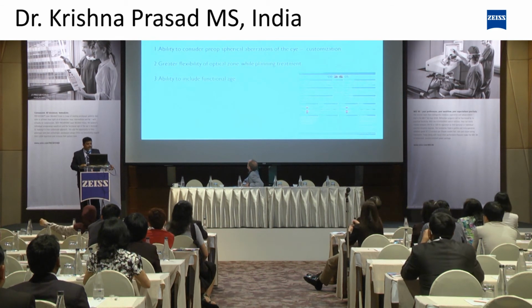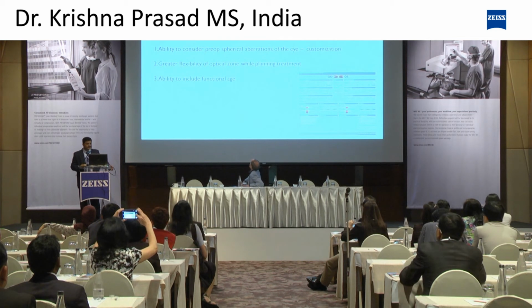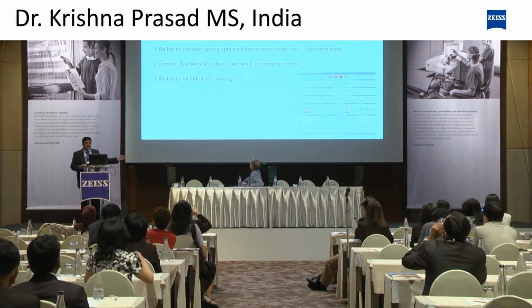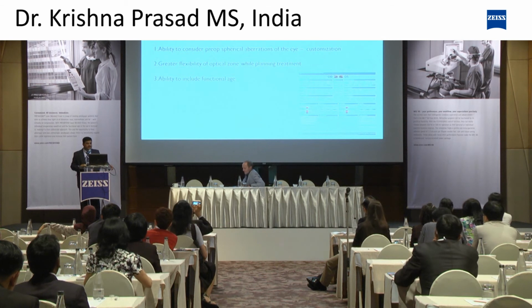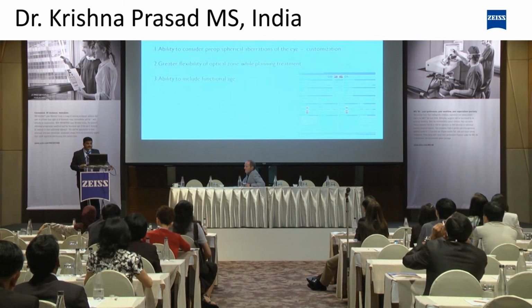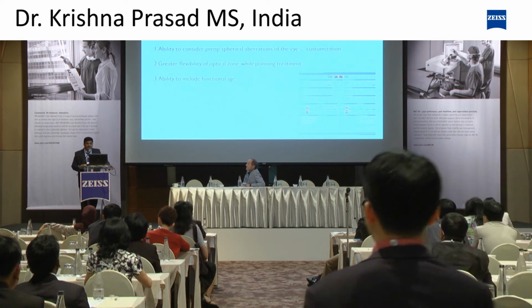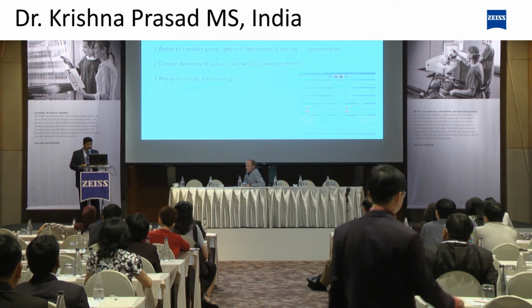Coming to the new software that is available nowadays, they are giving the laser blended vision software. Now they are coming with the newer Presbyond software. The advantage is that it has the ability to consider the preoperative spherical aberration of the eye, so you can do a customization. There is also greater flexibility of optical zone while planning treatment, and you can even include the functional age.